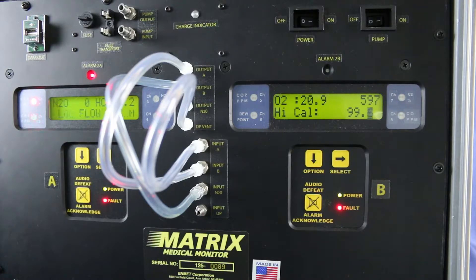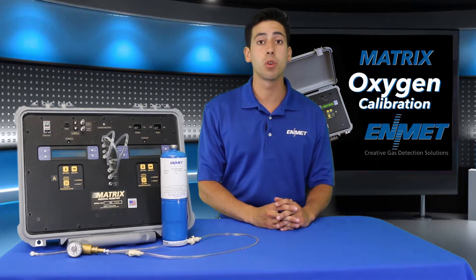The display will read 'high cal' on the bottom line and the oxygen concentration will be displayed next to the high cal. It will either be 20.9 or 99.6 depending on the oxygen concentration you are using to calibrate the instrument. You may use the option key to change the value to match your calibration source gas concentration if required.